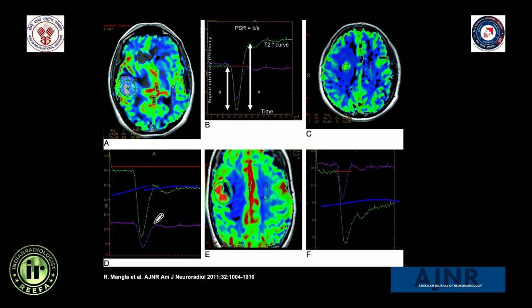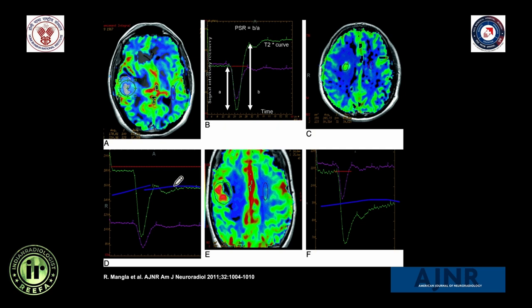Why do tumors show different baseline recovery? In lymphoma, T1-weighted effects predominate due to cellularity, vascular arrangement, and lack of blood-brain barrier, causing baseline overshoot. In glioblastoma, leaky vessels allow contrast extravasation into the tumor interstitium, causing predominant T2* effects and lack of complete baseline recovery. In metastasis, absent blood-brain barrier similarly leads to contrast leakage, T2* effects, and poor baseline recovery.